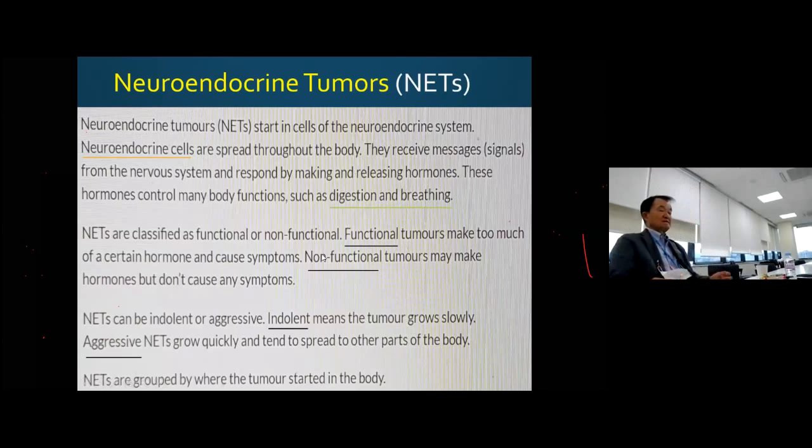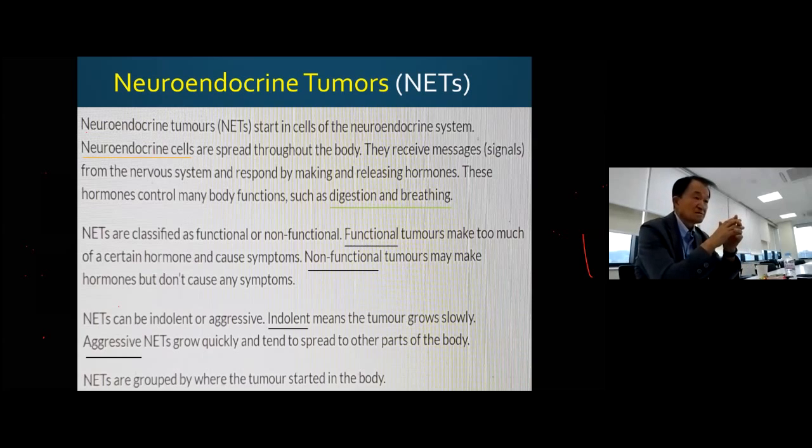Okay, so you have to educate your endocrine or general surgeons that you can help them locate the parathyroid adenoma precisely and in short time, with this specificity, using sestamibi or any amino acid or tumor radiopharmaceutical, and then show some of these kinds of cases, and then they will test you.